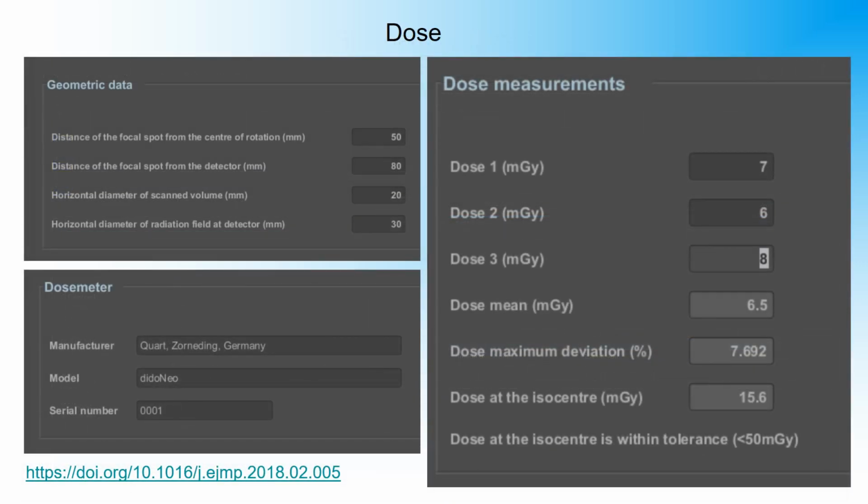In order to connect the data we acquire to a dose measurement, there are two ways of entering a dose into the software. One is a standard CTDI measurement, and this is the dose measurement we suggest for cone beam CT applications and also adopted in the DIN standard.